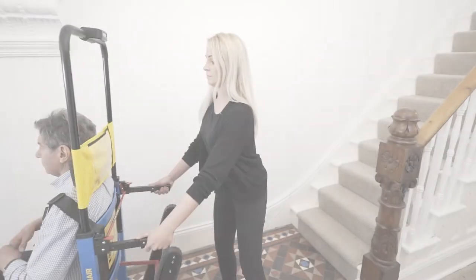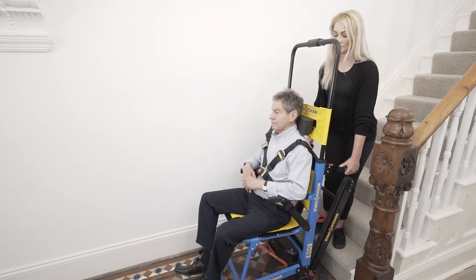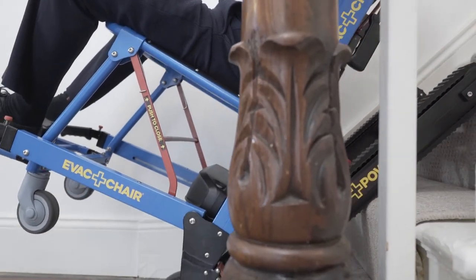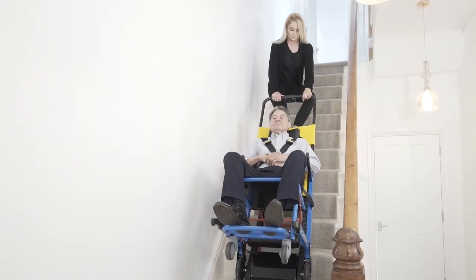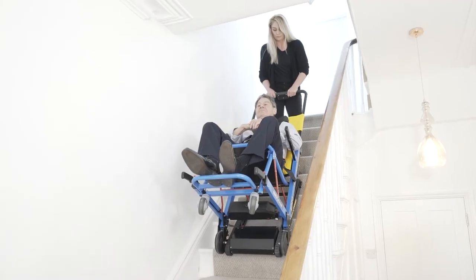For stairway ascent, move the top handle to the desired locking position. Move the chair backwards until tracks meet the bottom stair edge. Then tilt the chair back to the balance point until tracks meet the bottom two stair nosing and press the up arrow on the control panel. Keep the up arrow depressed and allow tracks to meet their glide angle.